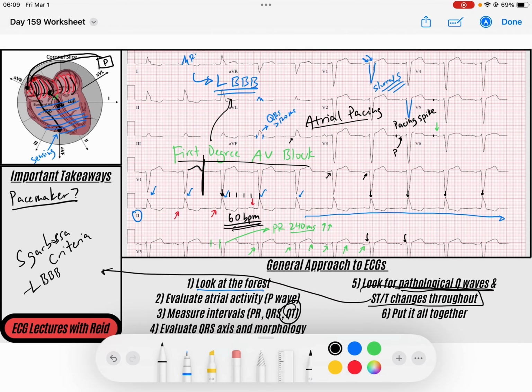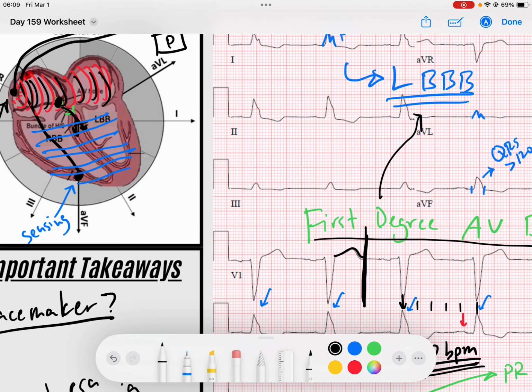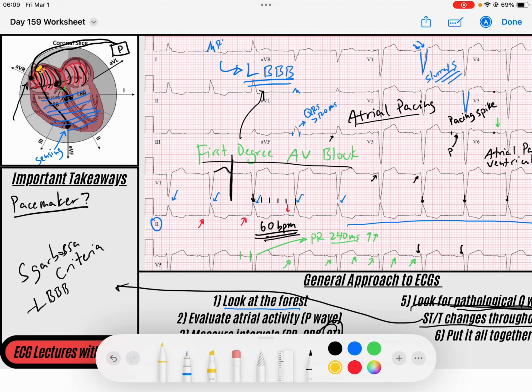And so what is the pacing type of situation that we have here? We have something called atrial paced ventricular sensed, right? And that's meaning that every 60 beats per minute, the rate, that initial lead, that right atrial lead, is waiting. It's waiting for the sinus node. It's waiting for the sinus node to beat. And if the sinus node does beat, it would inhibit that lead, but it doesn't, right? This person's sinus node is not doing great. And so that atrial lead is pacing for the sinus node.